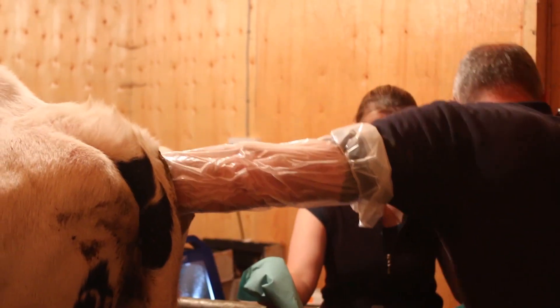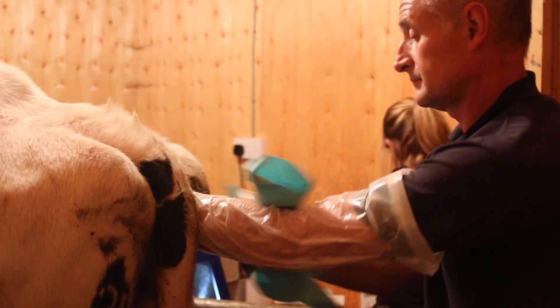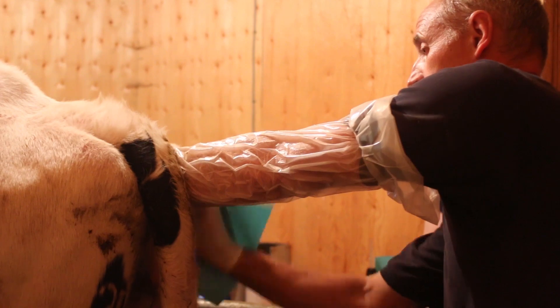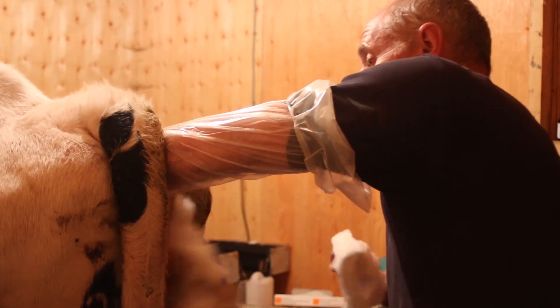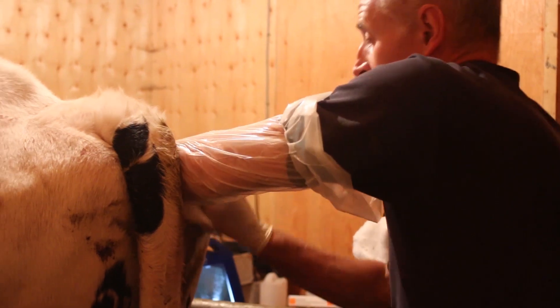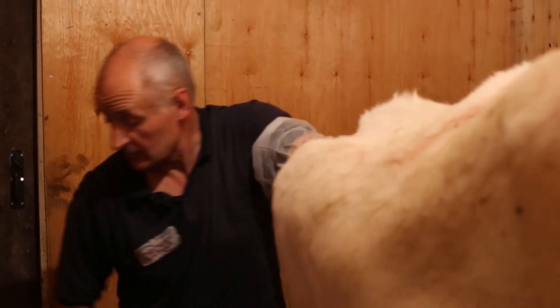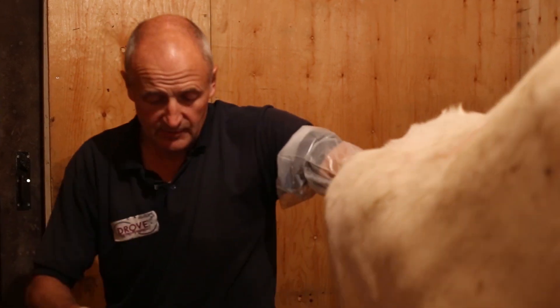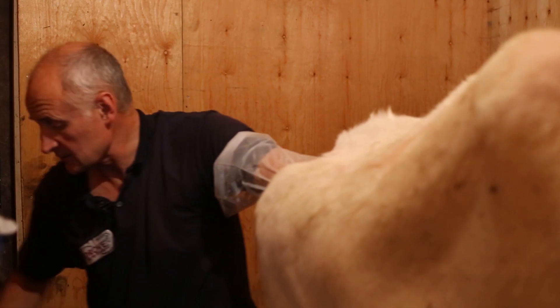Always just check at this stage that the reproductive tract is normal and I can find both of the ovaries and pull them up out of the bursa to make sure I can undertake the procedure safely. I double glove so I can keep my arm inside the rectum while I clean her up so that no air gets into the rectum, because it makes it difficult to do the procedure if it does. There's a cleaner glove now.